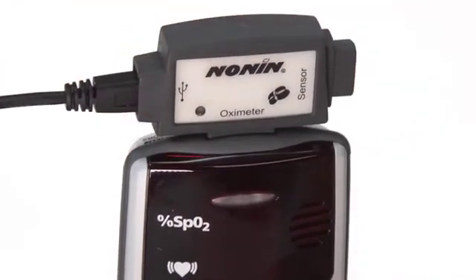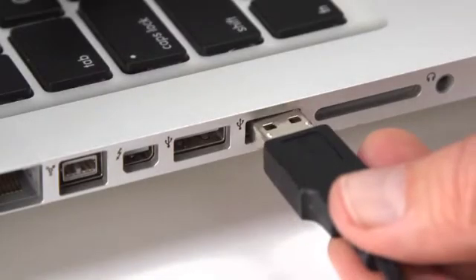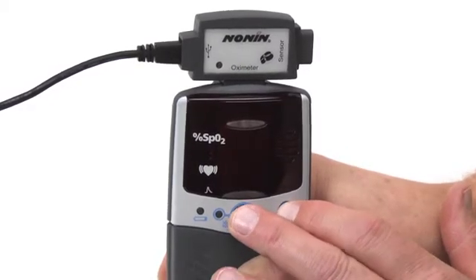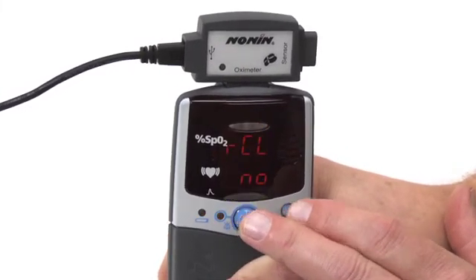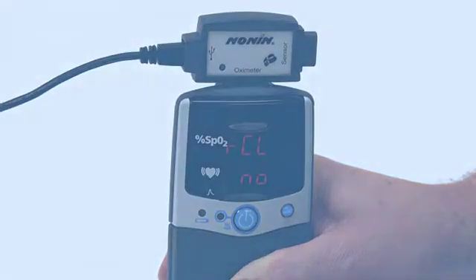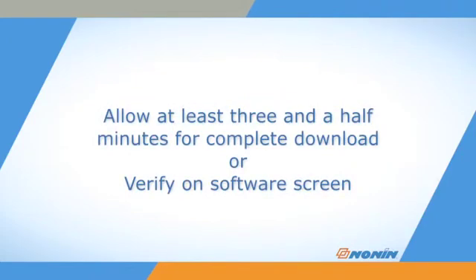To download the 72-hour memory from the oximeter, attach the appropriate cable or data collection drive with the 2500 model turned off. Press the ADVANCE and ON-OFF buttons and release only the ON-OFF button, just like entering Setup mode. When the CLEAR NO icon appears on the 2500 model, or the recall alarm setting NO appears on the 2500A model, the oximeter memory will begin download. Wait for at least three and a half minutes for the data to transfer to the computer or data storage drive.